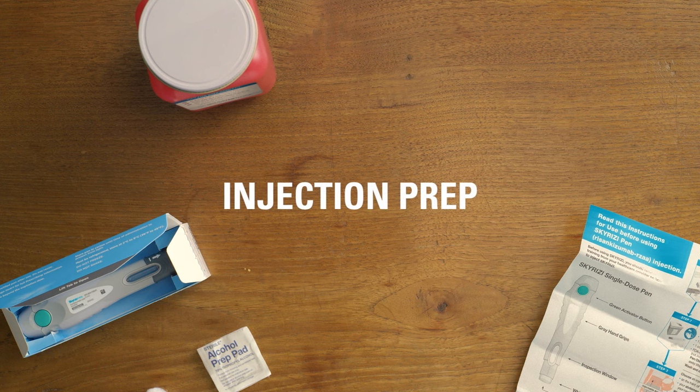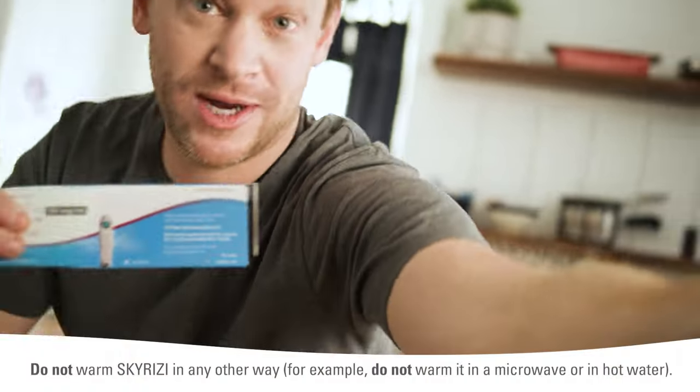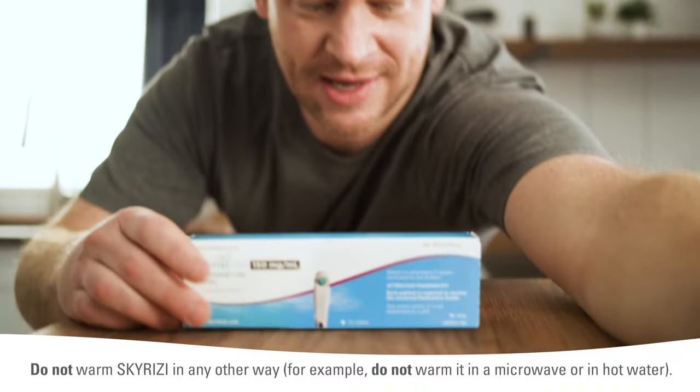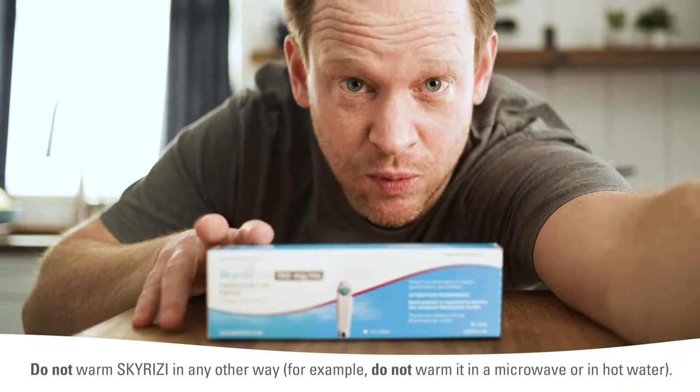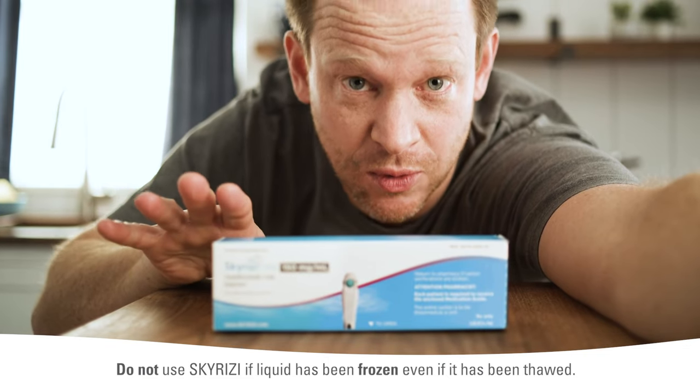Now, I get my Skyrizi by mail, and I keep it in the fridge until I'm ready to inject. I'll leave it out at room temperature and out of direct sunlight for 30 to 90 minutes before injecting.